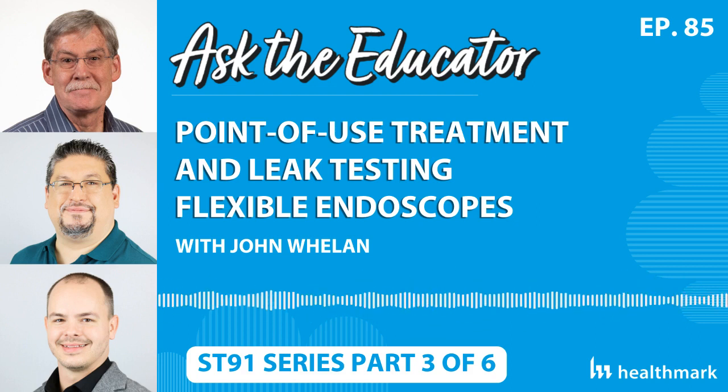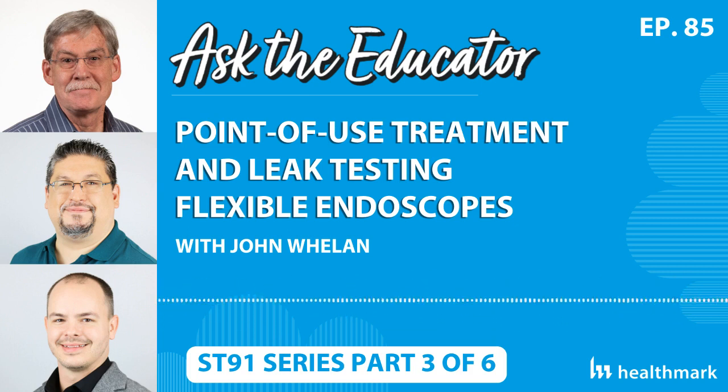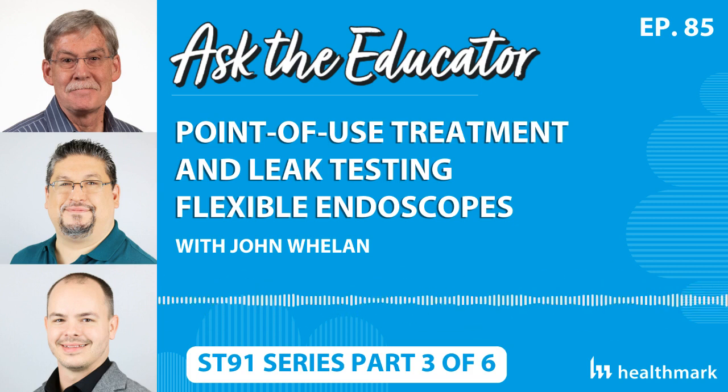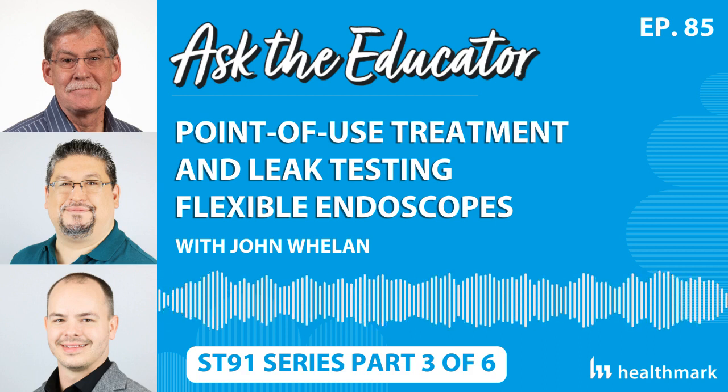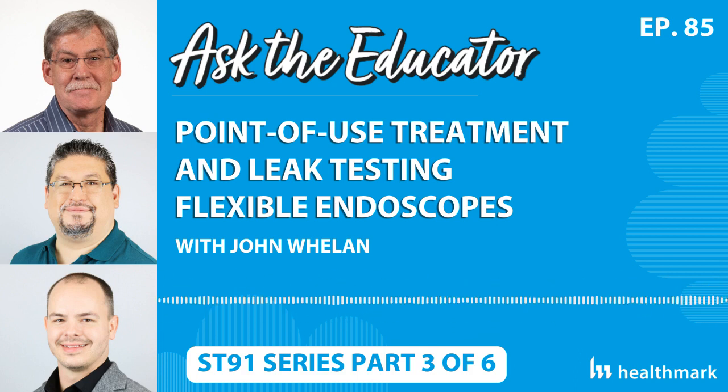And as we travel around the country providing consultations to facilities, we're still seeing that people are tripping over how to make it happen. But the intent of it is where you pass along the time that point of use treatment was performed, pre-cleaning was performed, to the processing staff so that they then know whether they need to institute delayed processing, extended cleaning, based on manufacturer's instructions. So the handoff communication from the procedure room needs to minimally include patient identifier, date of procedure, time that point of use treatment was completed, and it can be in various forms.